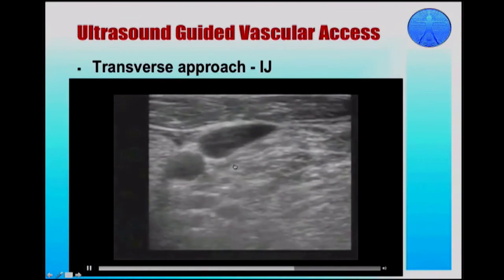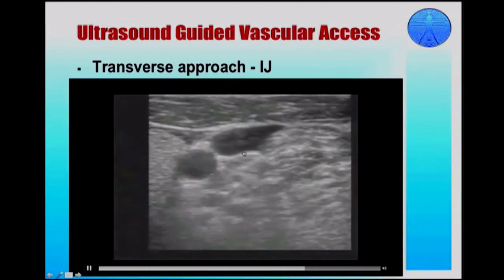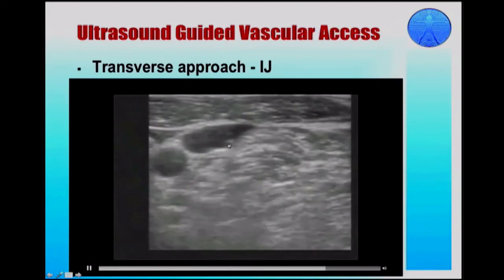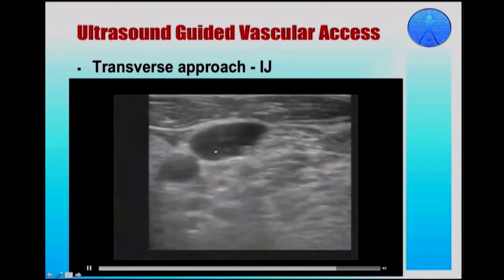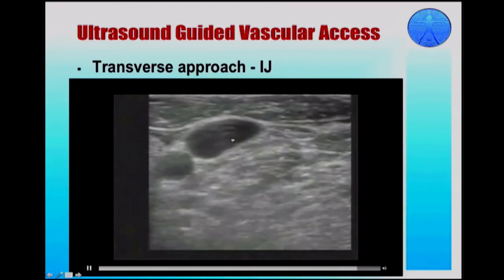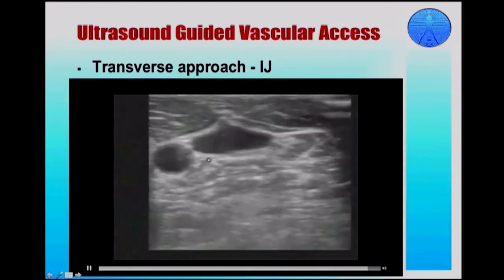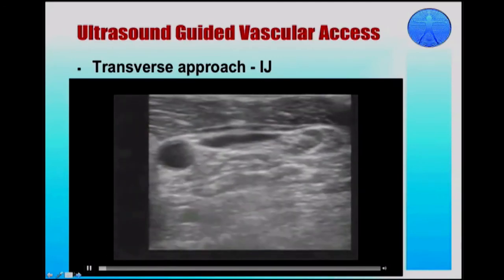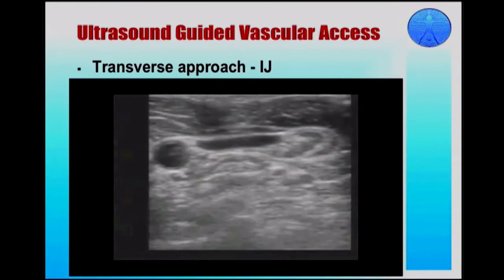Could have said, slide your probe down and find your needle. But in this case, pull your needle back. You can see how it's through the back wall. That's still needle shaft. They're still pulling it back, pull it back, pull it back. Come on back some more. And there's the needle tip sitting now in the vessel right there. So they finally got it after all that. So you must follow your needle tip as you go through this procedure.